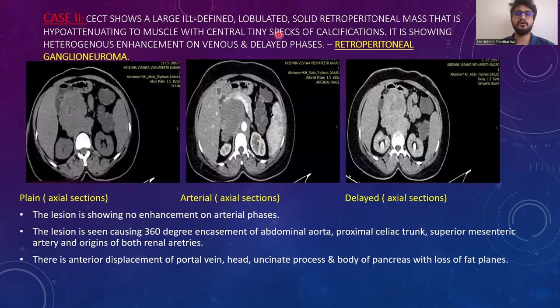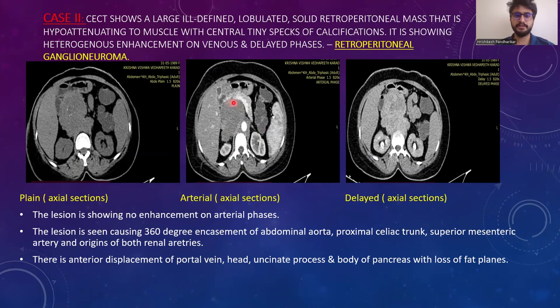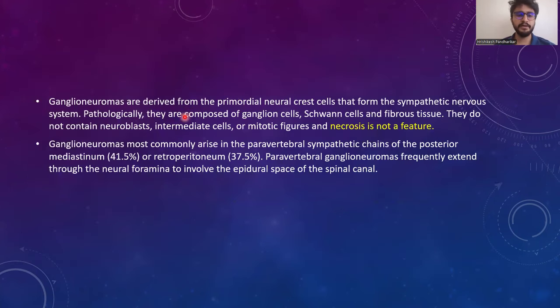Case 2: CCT shows a large well-defined lobulated solid retroperitoneal mass, hypoattenuating to muscle, with central tiny specks of calcifications, showing heterogeneous enhancement on venous and delayed phases. This is a case of retroperitoneal ganglioneuroma. The lesion shows no enhancement on arterial phases and causes 360-degree encasement of the abdominal aorta, celiac trunk, superior mesenteric artery, and origins of both renal arteries, with anterior displacement of the portal vein, head, uncinate process, and body of pancreas. Ganglioneuromas are derived from the primordial neural crest cells forming the sympathetic nervous system, composed of ganglion cells, Schwann cells, and fibrous tissue, without neuroblasts or necrosis. They most commonly arise in paravertebral sympathetic chains of the posterior mediastinum or retroperitoneum.